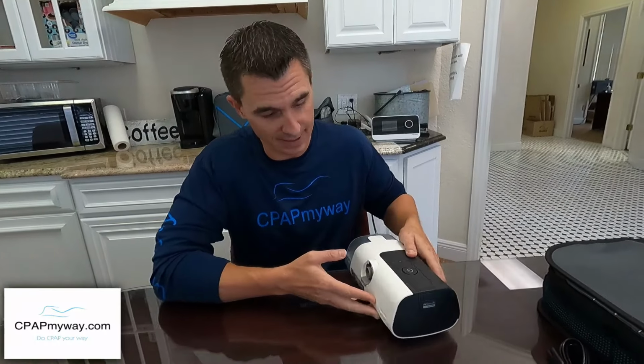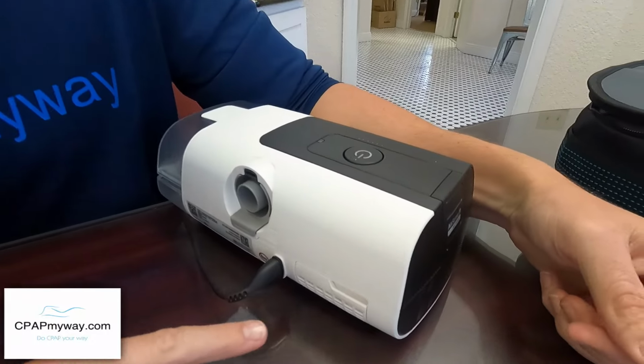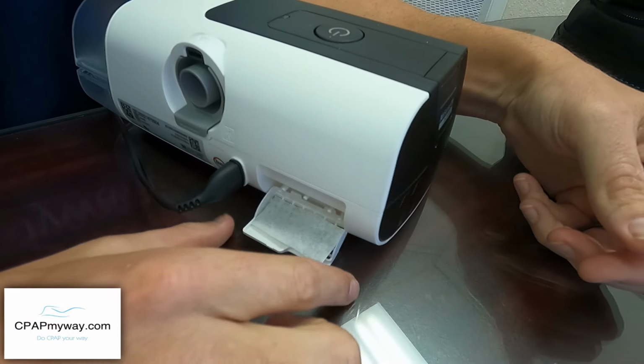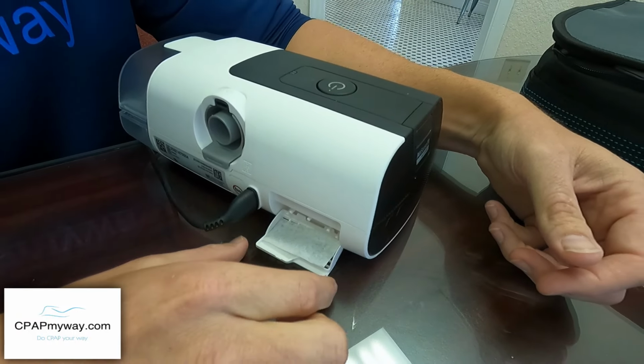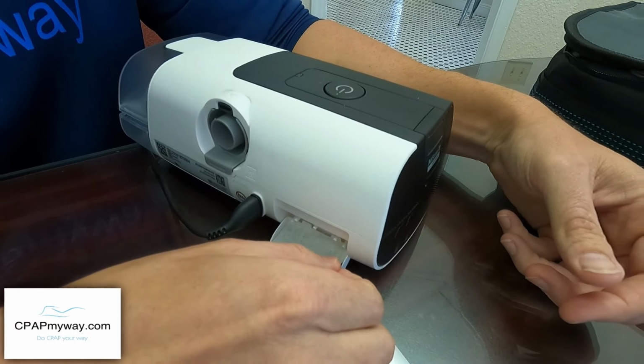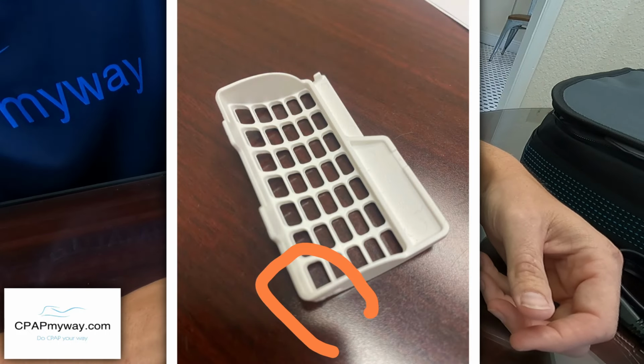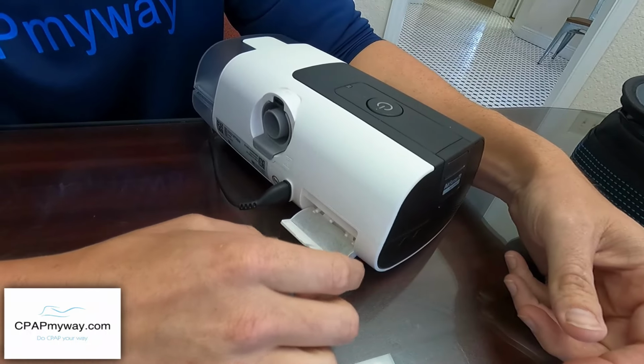The other thing that really jumped out to me as a problem, because I broke it, is the filter housing here. When you flip that down, you've got to be careful about pushing down too hard. It is built to kind of pop out of there, but I pressed down too hard on it right at the beginning, and I broke it out of there. The little tabs would not go back in after that. I had to order a new part.